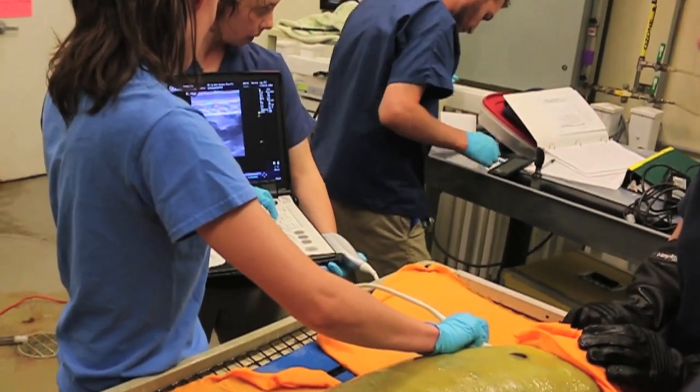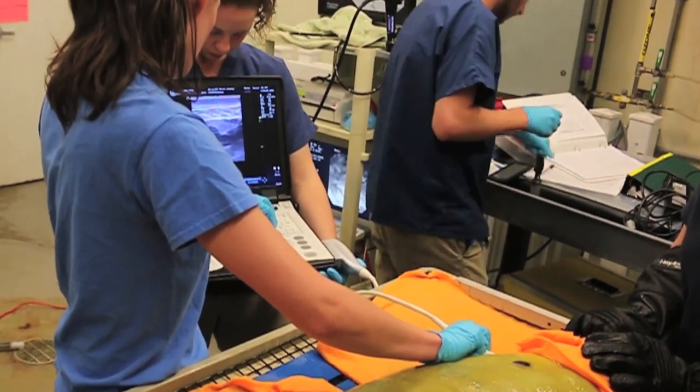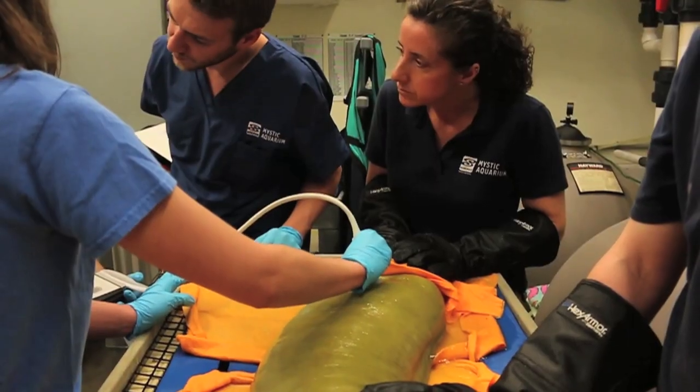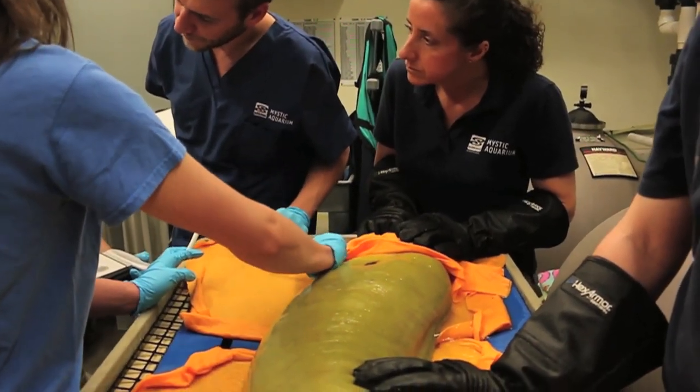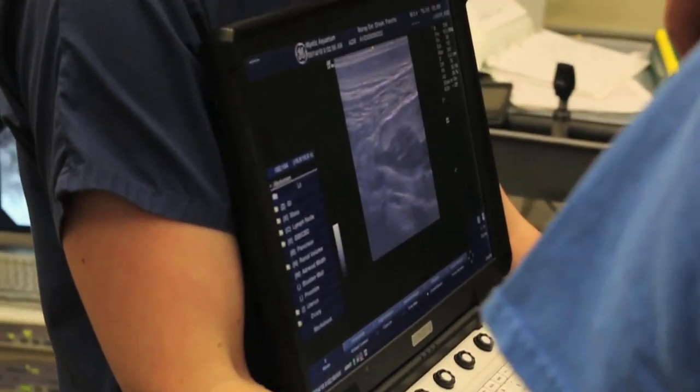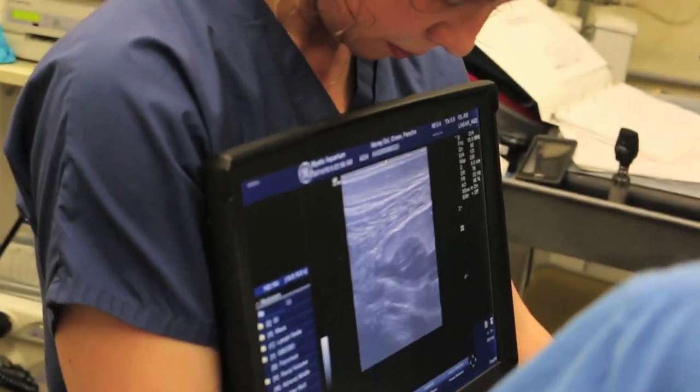We will also do an ultrasound, which gives our vets the opportunity to evaluate their heart rate, see their heart valves actually pumping and moving, see their liver and evaluate the health status of their liver based on appearance, and can also sometimes help us determine what gender our animals are.